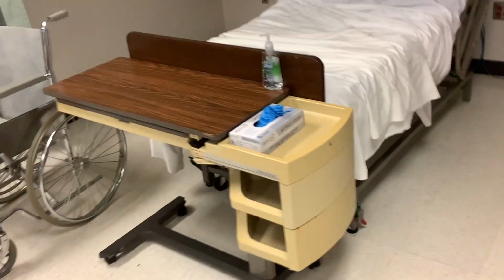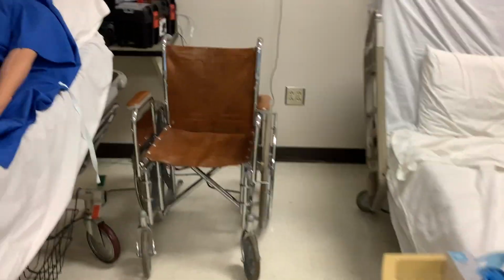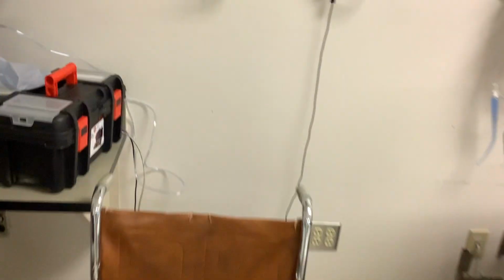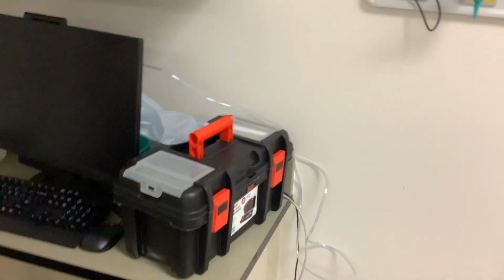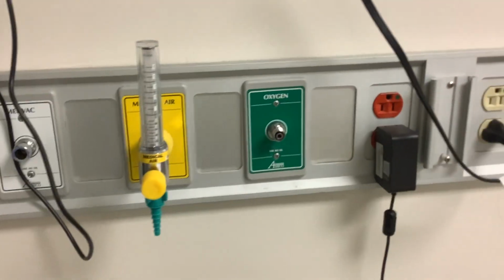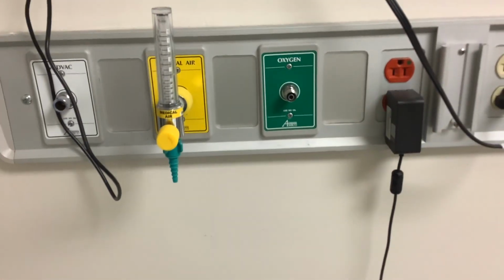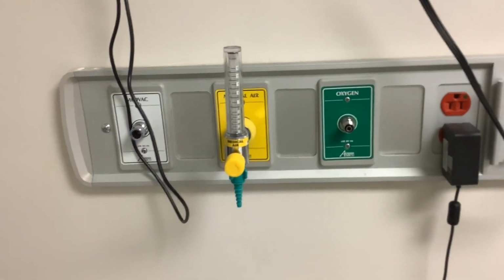So just to kind of talk about flow meters right quickly, let me find a lab station that has them. So got them over here. Let me get this wheelchair out of the way. And this is a medical air flow meter. You've got an oxygen flow meter. We're learning about safety systems as well. So you've got the diameter index safety system that's utilized with your wall station outlets.